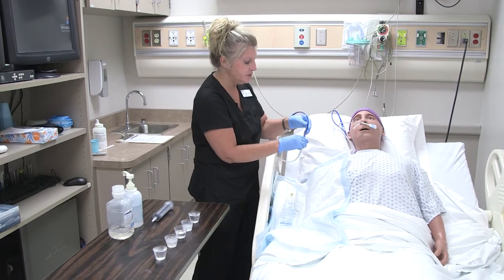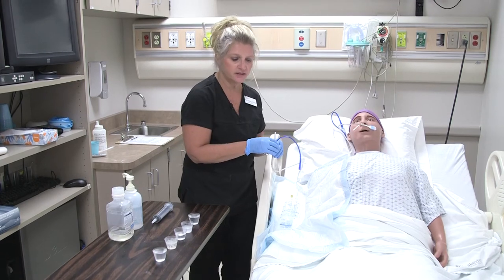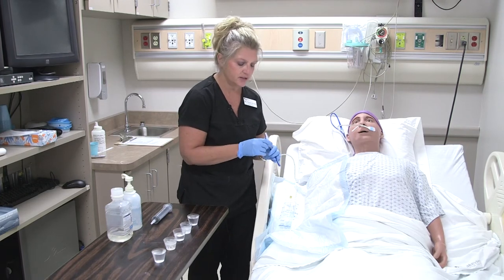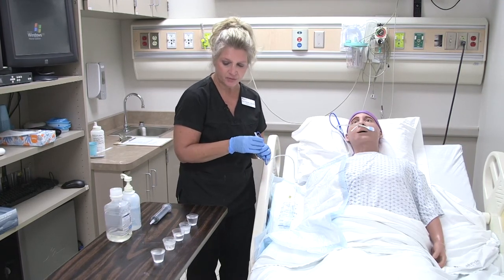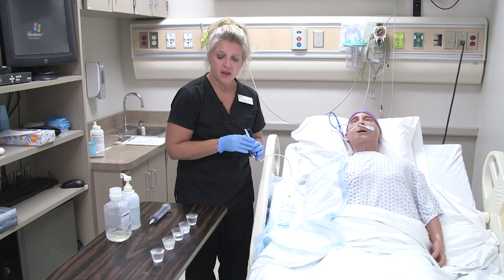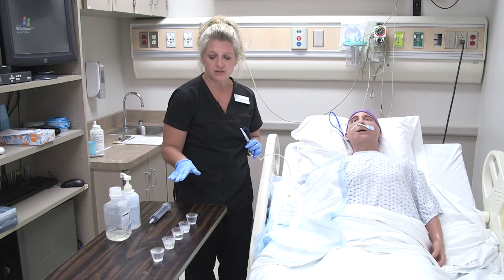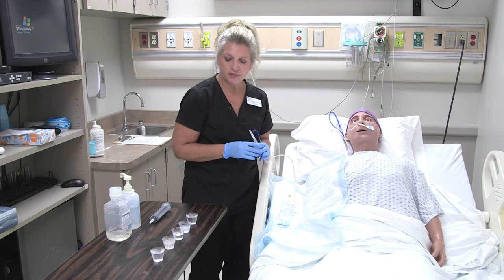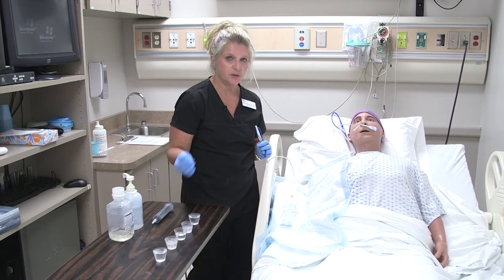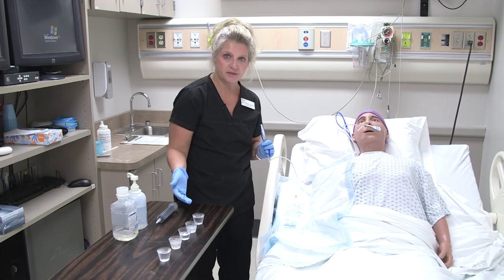The tube is not connected to suction. Both of these medications do not necessarily need to be given on an empty stomach, nor do they need to be given with food. I also checked them all three times with my MAR and have all my medication checks done. They are crushed and already diluted. When giving medications through an NG tube, you do have to dilute them — you can't just put the powder down the tube. You have to dilute with 5 to 15 mls of fluid.